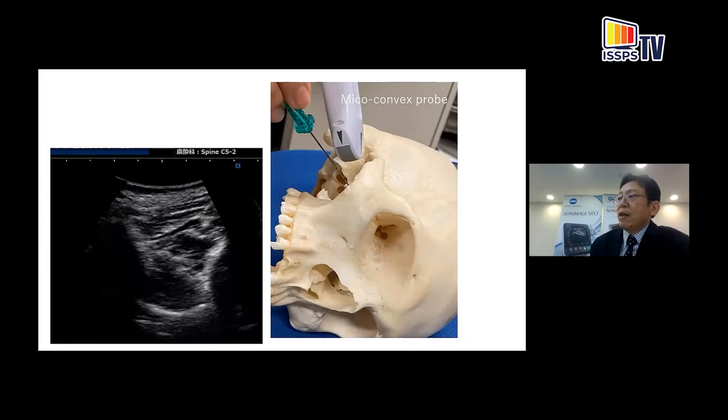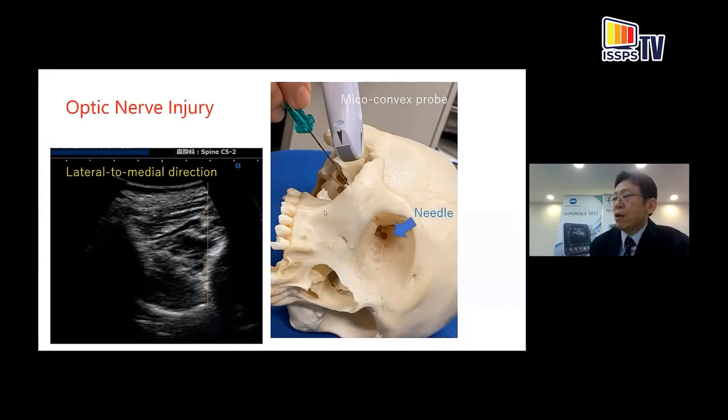Sometimes I use a microconvex probe. In that case, we can insert the needle in a lateral-to-medial direction. We have to be careful not to insert the needle too deep into the pterygoid fossa, because there is a risk of optic nerve injury. Can you see the needle tip here?